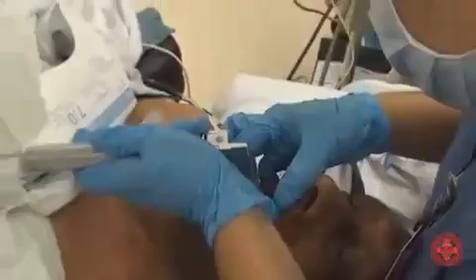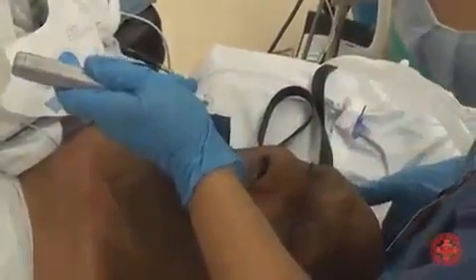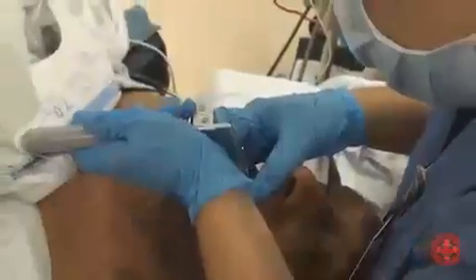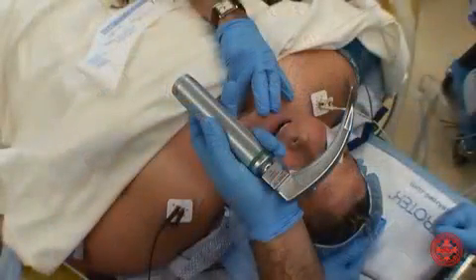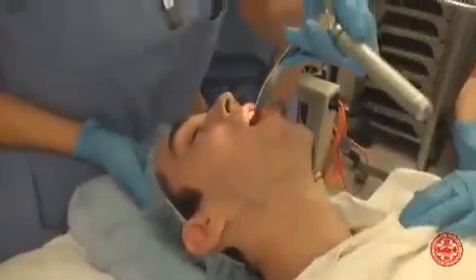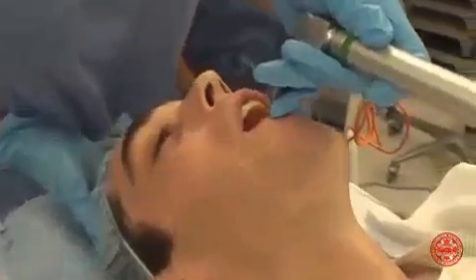The direct laryngoscopy is performed with the patient's head on a pillow to align the oral cavity with the larynx. While holding the laryngoscope in the left hand, the anesthesiologist opens the mouth using the right hand. Alternatively, an assistant may depress the jaw and open the mouth. The laryngoscope is carefully inserted into the oral cavity on the right side, and the tongue is retracted to the left.